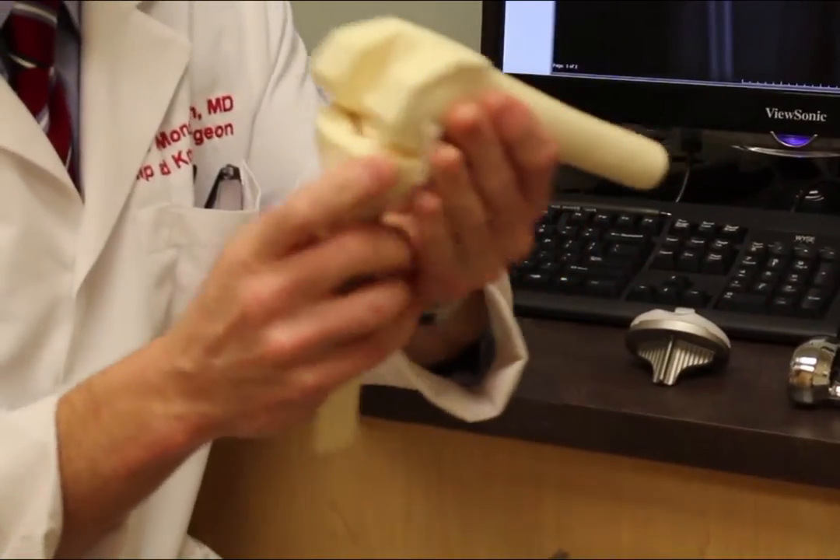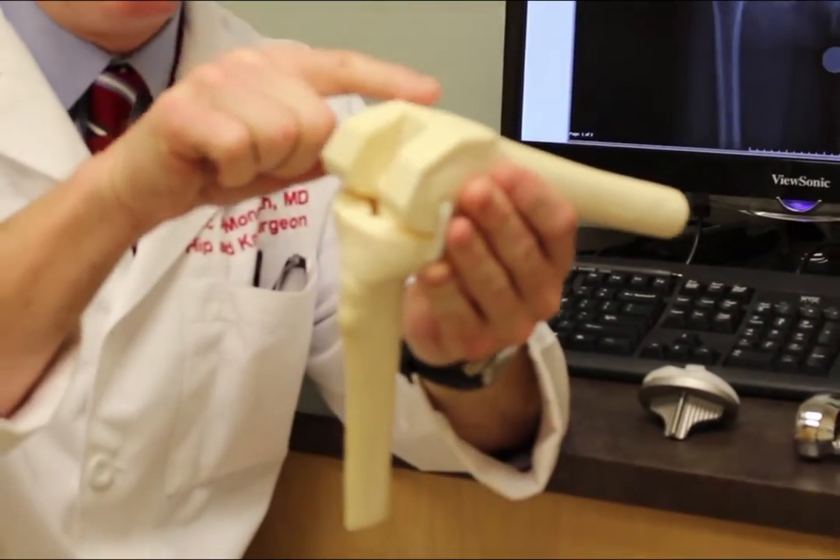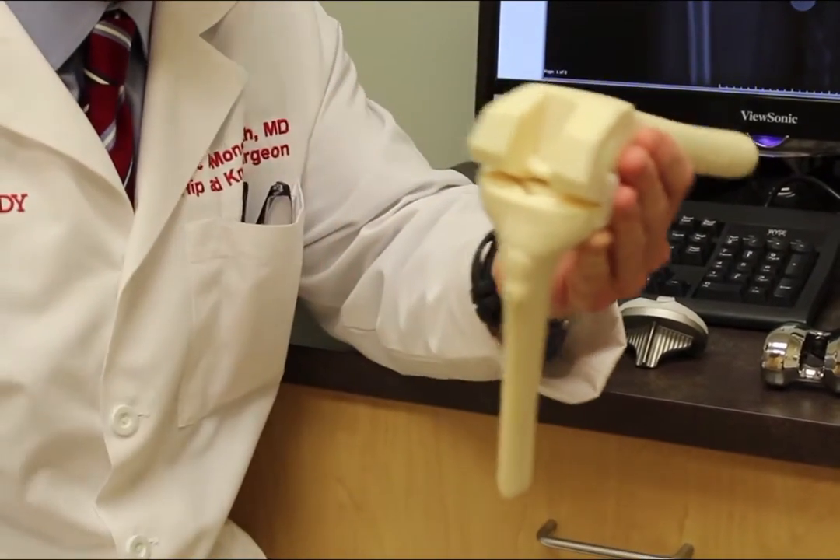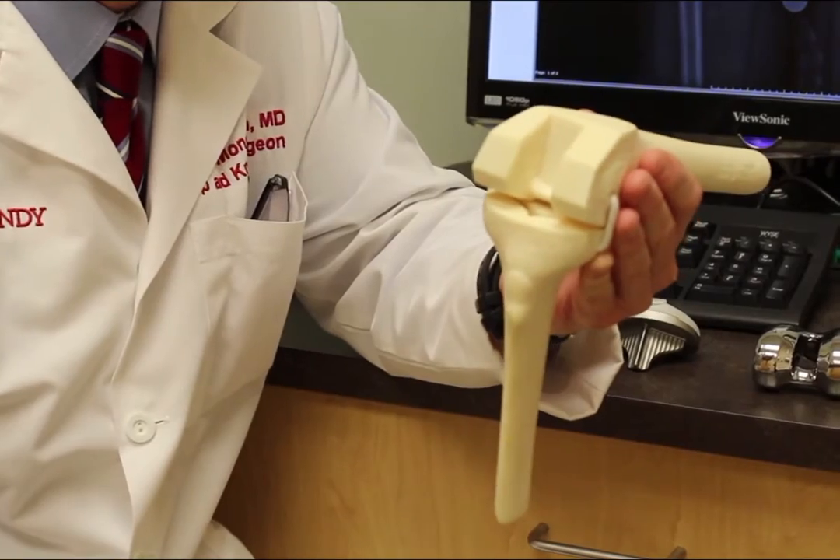On the end of the thigh bone, we make five cuts: a top, a bottom, an end cut, and then these are called chamfer cuts — and we do that using our computer navigation.